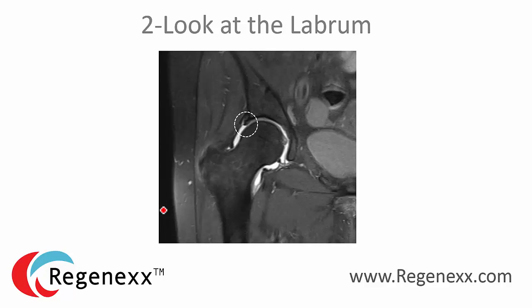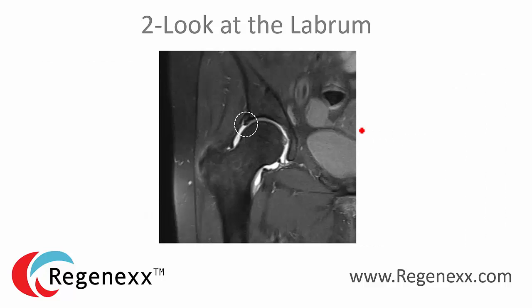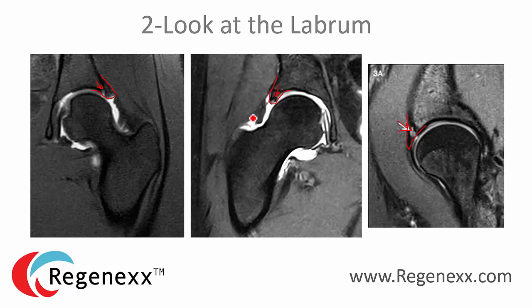Number two: look at the labrum. The labrum is the lip around the socket for the ball-and-socket joint. I've shown you three different labral tears here. You can see the labrum, and there's a white or light area in the labrum that represents a tear — you can see this in all three examples. Going back, a normal labrum doesn't have much white in it, whereas the torn ones show those light areas.